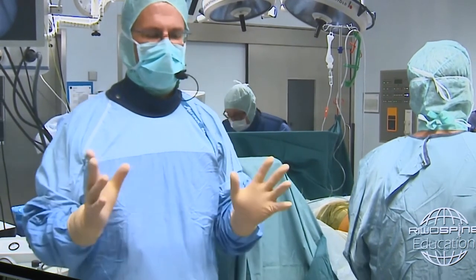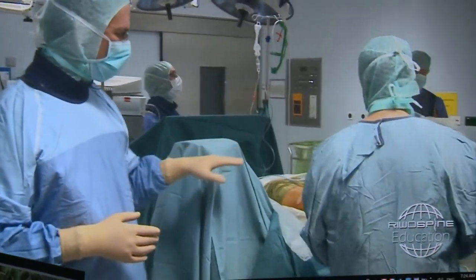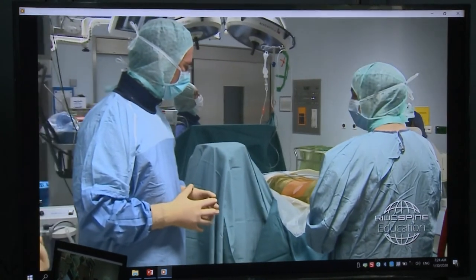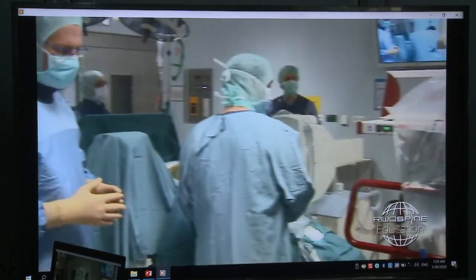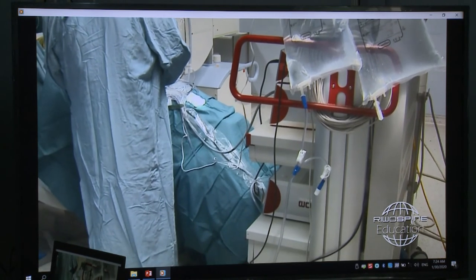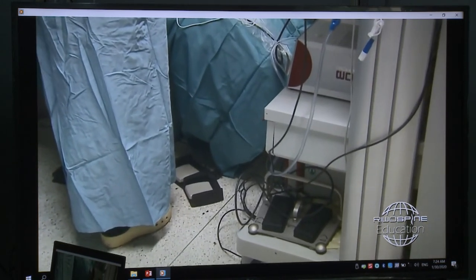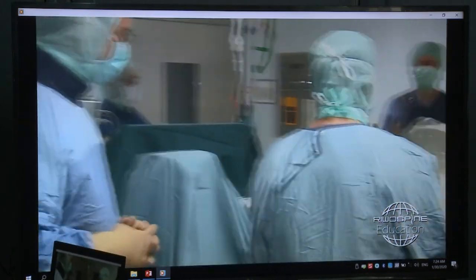Okay. We just have a short look around to see the complete setup. We have the patient on the table in prone position, with two rolls on the chest and iliac crest, just to have the stomach relaxed. Then we have the instruments here: radio frequency, light source, endoscope, camera, and the pump. And below that we have the drill unit, but we will not need it for this case.